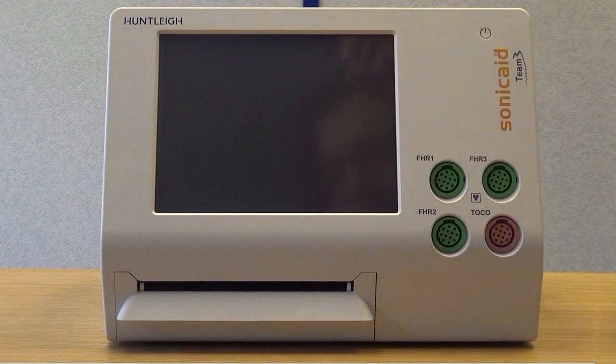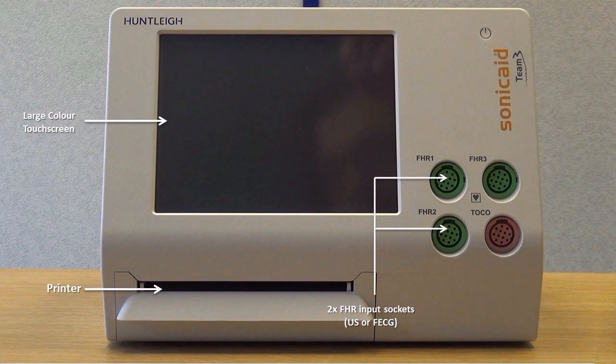On the front of the unit, you will find the following: a large colour screen, a printer, and two FHR input sockets for the ultrasound transducers. In Team 3I models, any one of these can also be used for FECG monitoring.